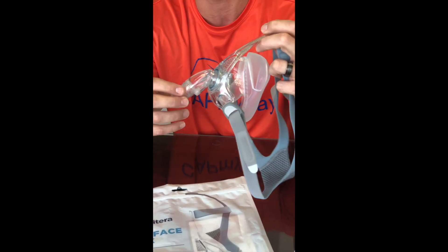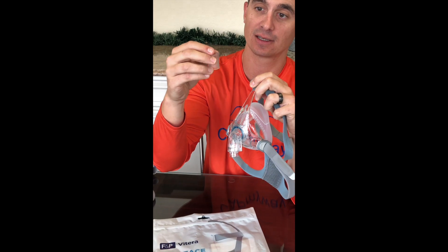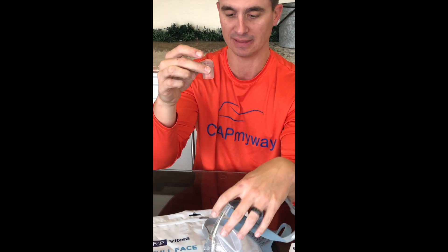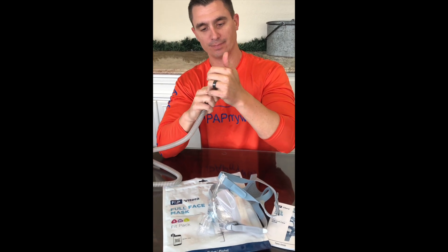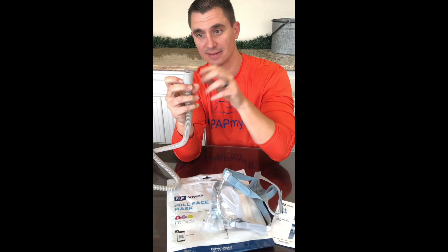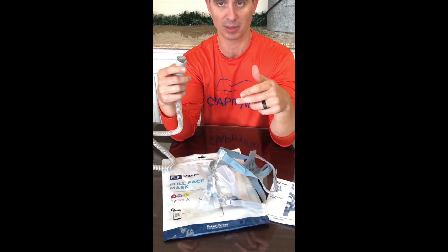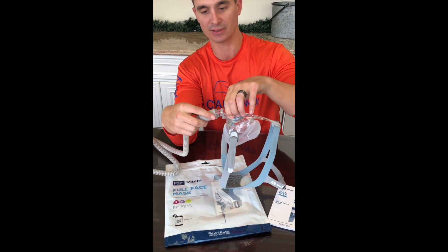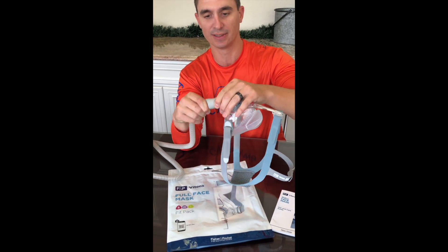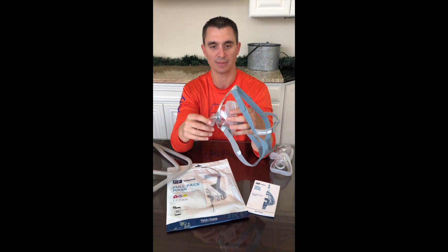It does have a quick connect feature on the front, just like the Simplest did. This is a clear and very small connector piece. I want to point out that if you've got it in the end of your CPAP tube, it is really easy to forget that it's there. So when you try a different mask or you get a replacement mask and you can't connect, it's probably because your old connector is in there. On this mask in particular, it's very easy to lose inside the tube, so keep that in mind.